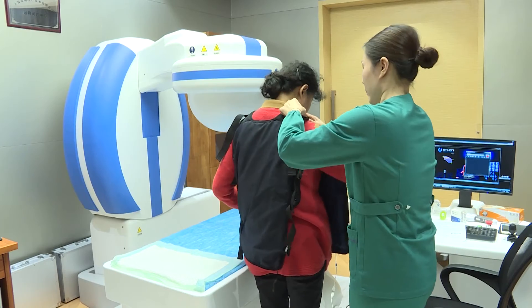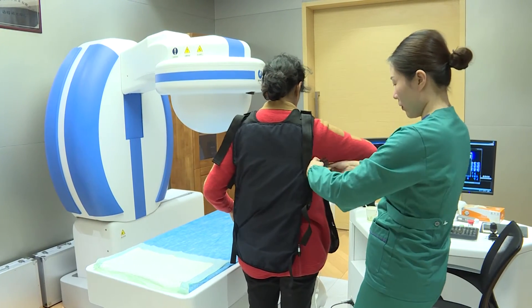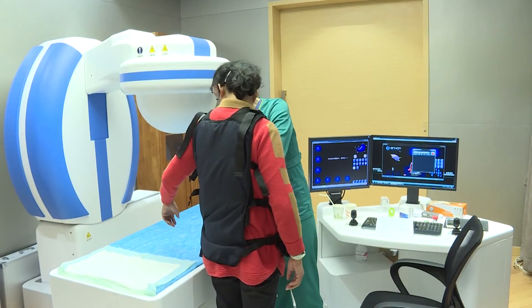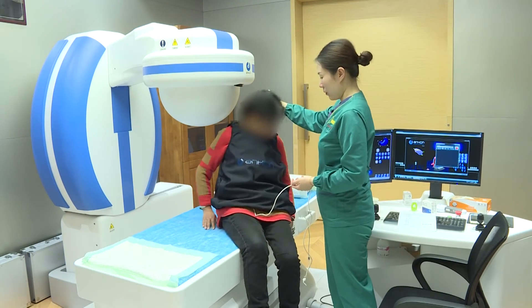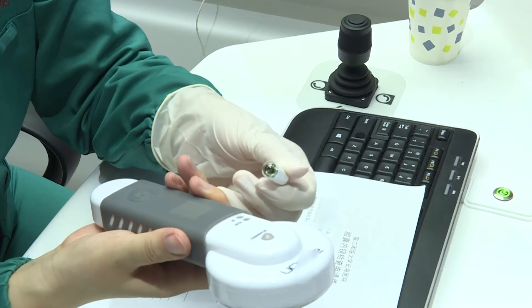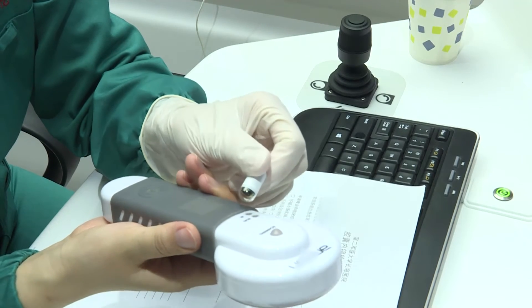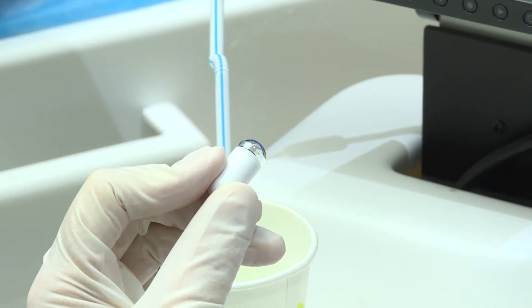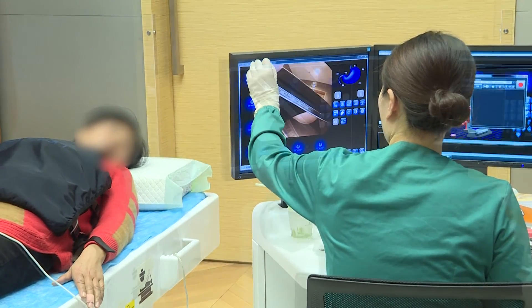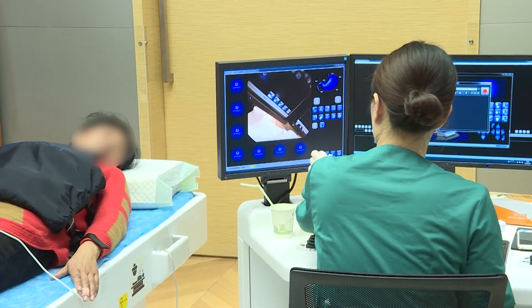A 52-year-old woman with recurrent upper abdominal pain for 3 months has already completed gastric preparation. She put on the data recorder with the help of an assistant, who then activated the capsule with a capsule locator. At the beginning of the examination, the patient's baseline characteristics were recorded through the capsule.